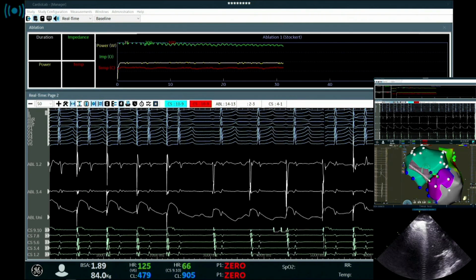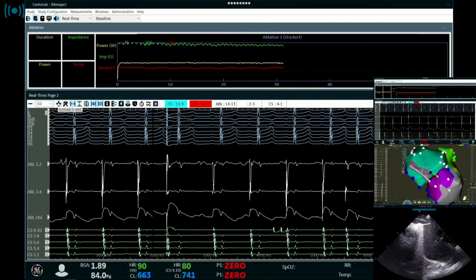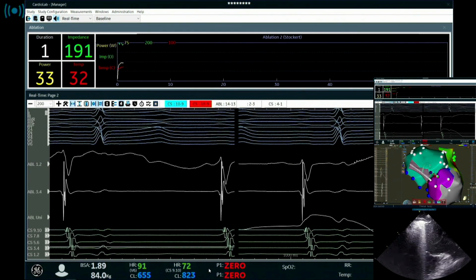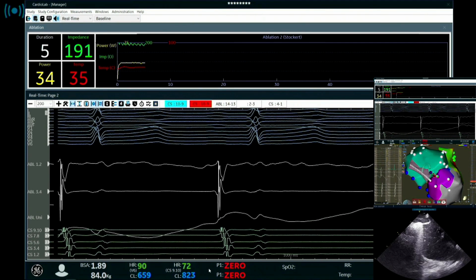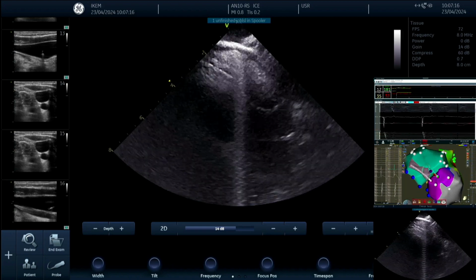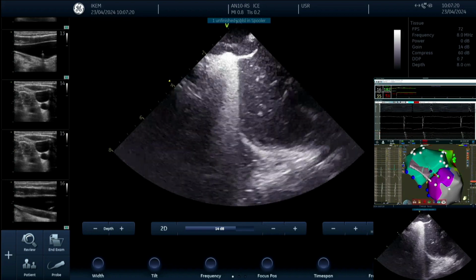So we did some studies in the past with Dan during AFib ablation, and we tried to modify also, we believed that maybe it will improve results of AF ablation. So all this knowledge which is now used for neuroablation has been already accumulated before, so it doesn't come from the blue.